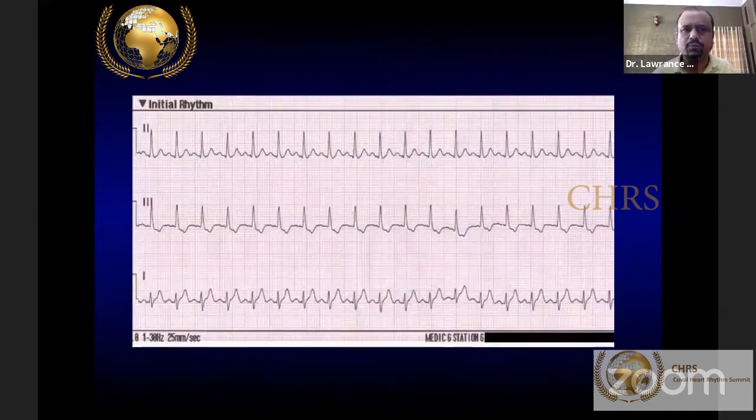You just look at this ECG. You have 3 leads here. This is a narrow QRS tachycardia, your QRS width is less than 120 milliseconds. This is very regular. And if you measure the RP interval, R to P and P to R, your RP interval is definitely longer than the PR interval. This is sinus tachycardia. This patient, you should have a 12 lead ECG.